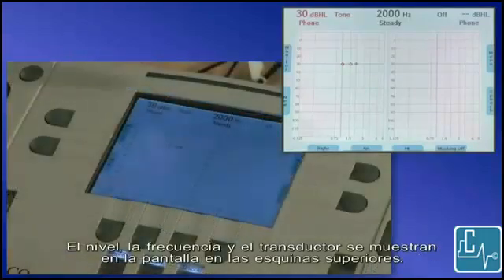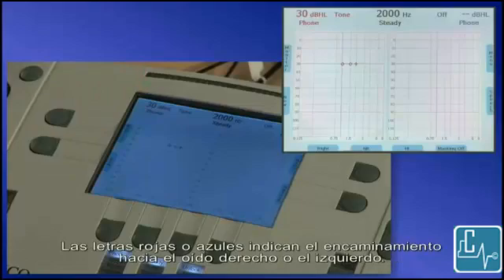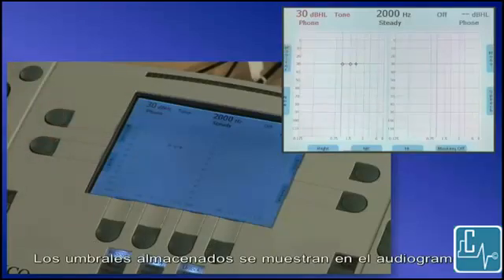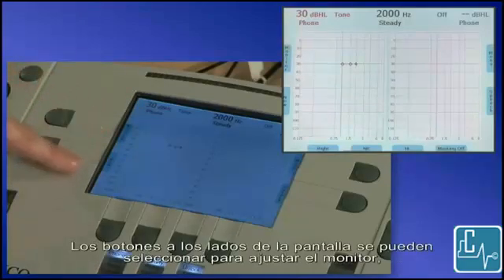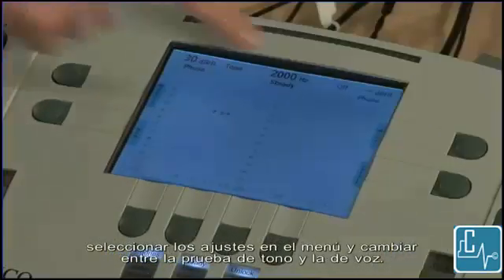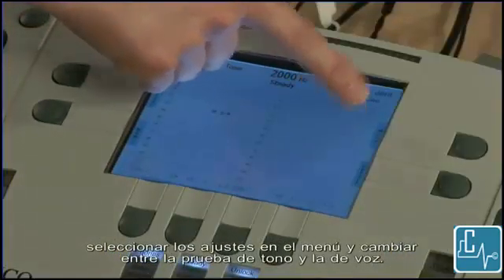Level, frequency, and transducer are all displayed on the screen in the upper corners. Red or blue lettering indicates routing to the right or left ears. Stored thresholds are displayed on the audiogram. Buttons on the side of the screen can be selected to adjust monitor settings, start a new test which erases stored thresholds, select menu settings, and toggle between tone and speech testing.